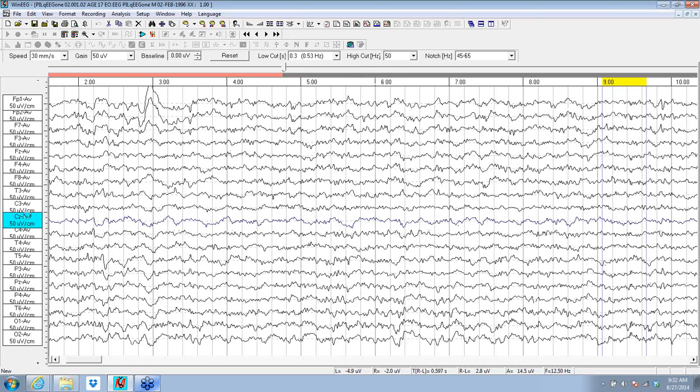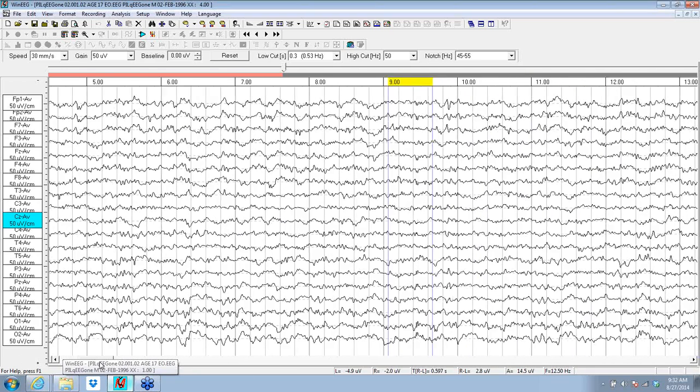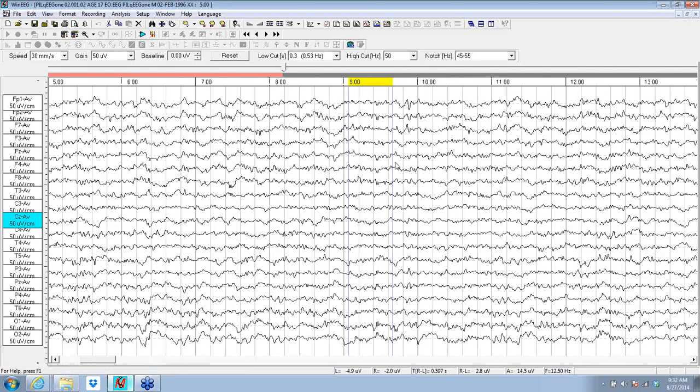Now, CZ is distinctly the source of dominant slowing. And yes, we can see that there's faster buzz scattered through the EEG. Eye blinks are up in the front, down in the back. This looks like real EEG now. And not all channels look like they're dancing together either. So when we corrected the montage, we basically take a clean look at things.